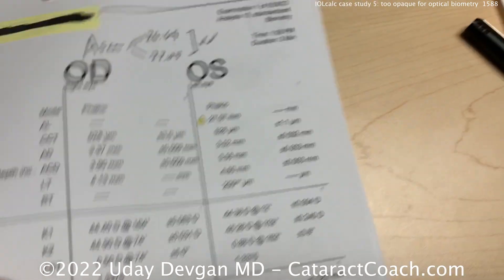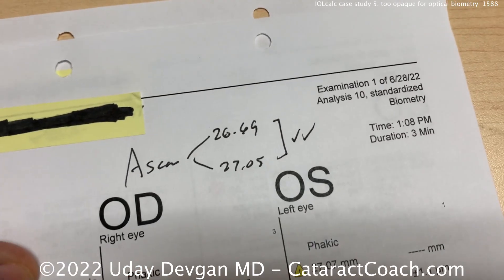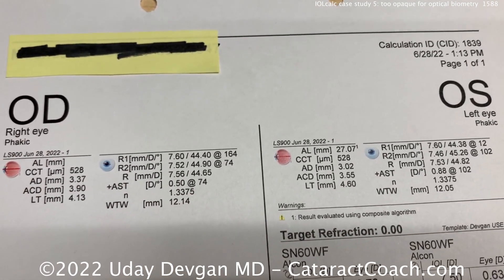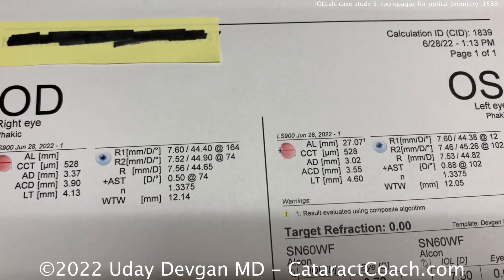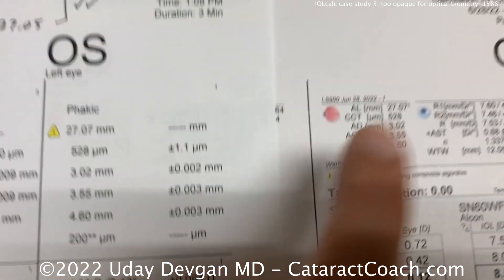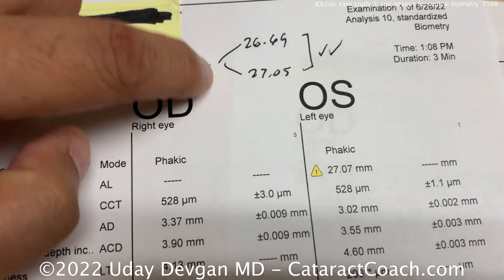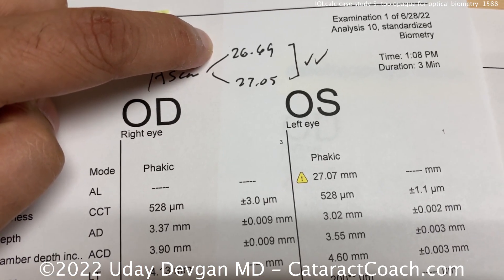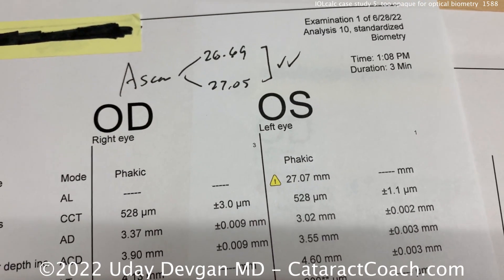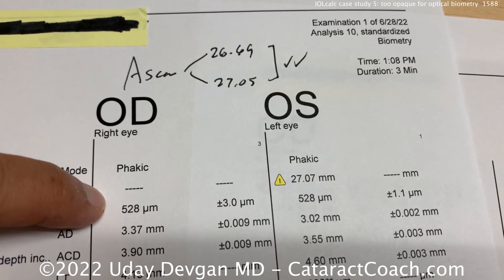So we're going to do an A-scan, and I do the A-scan myself. I always measure both eyes. If I already have an axial length for the left eye, why remeasure? To make sure my A-scan gives about the same measurement as I got from the optical — so I know I'm doing good technique. I got 27.05 on the left eye from the A-scan versus 27.07 from optical, so I'm pretty happy. I measured the right eye and got a shorter axial length: 26.69 — and I double-checked it.